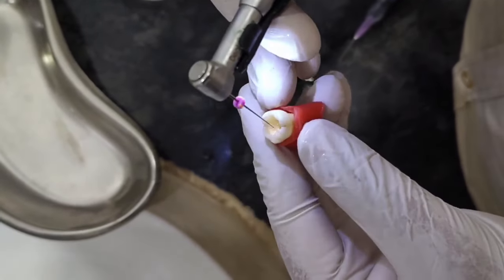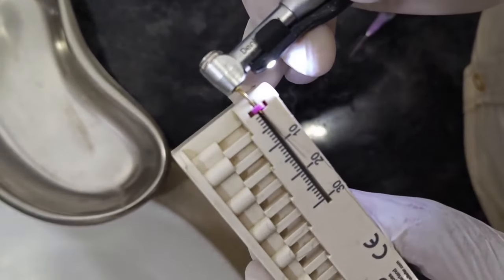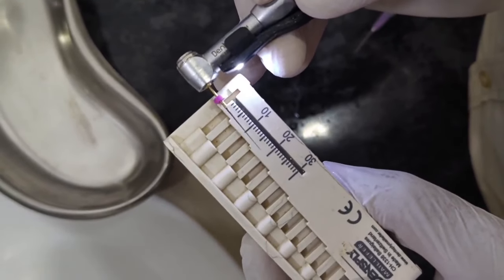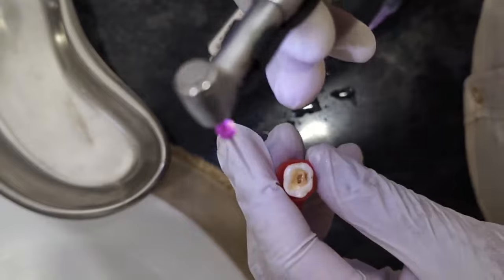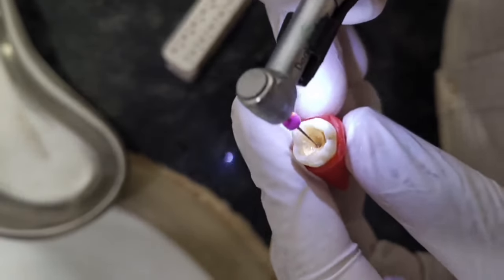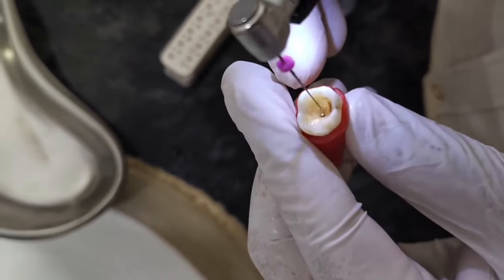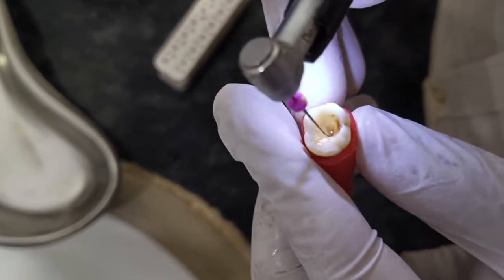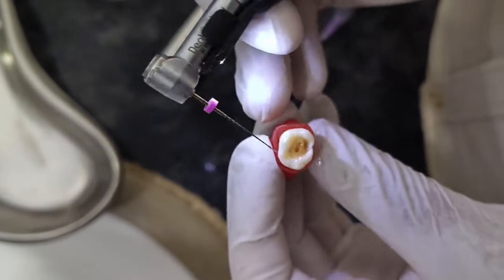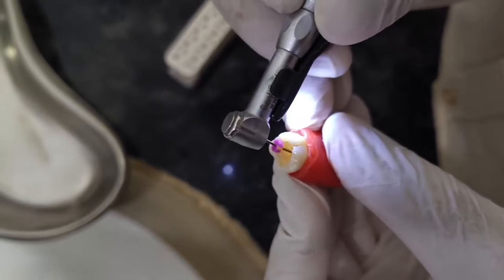So now we are inserting the endomotor. I am taking the working length over here. It's around 18 mm. So now I am inserting in the distal canal. You can see very smoothly it will go. So this is the first step, you have to check the patency of the canal. This light is coming from the endomotor. You have to see. So this is the patent.